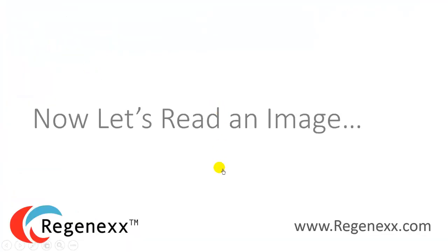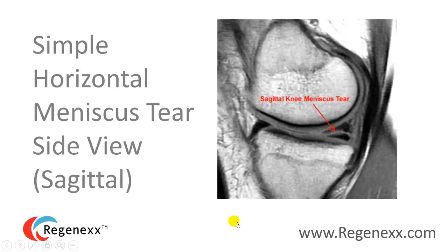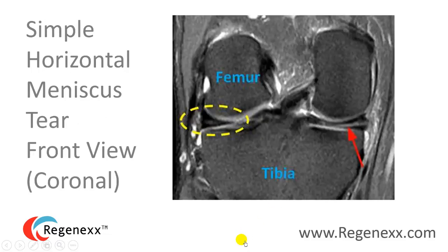Now let's look at what some abnormal meniscus tissue looks like. This is an example of a simple horizontal meniscus tear — you can see a horizontal light line in the dark triangle on the sagittal image, where the bone is bright, cartilage is gray, and the meniscus is dark. On the coronal view, the red arrow points to a white line that goes all the way through the meniscus. A normal meniscus is uniformly dark; this white line means a tear.